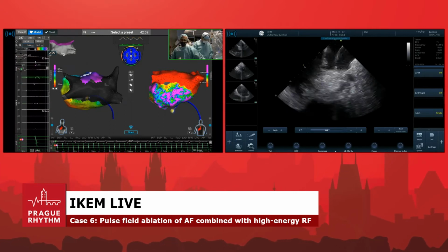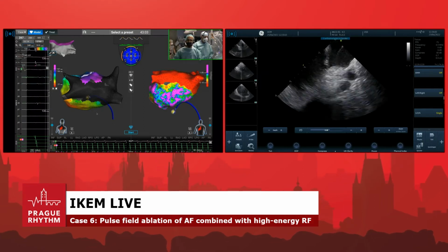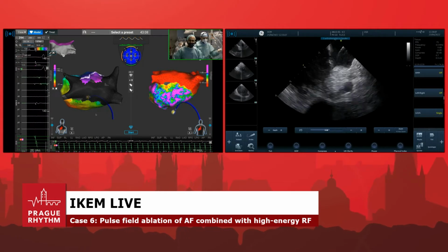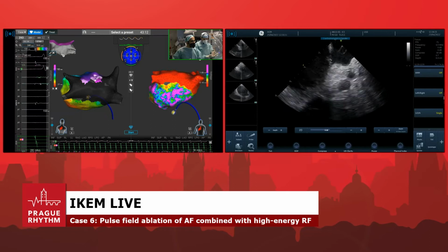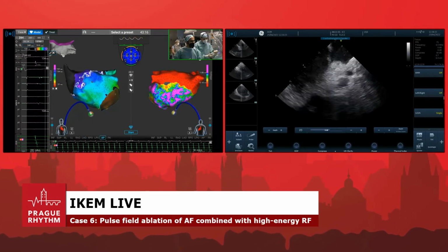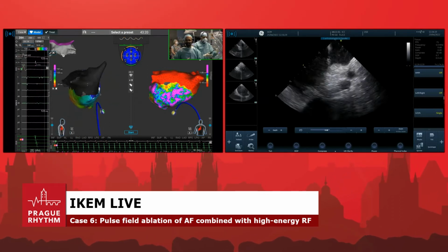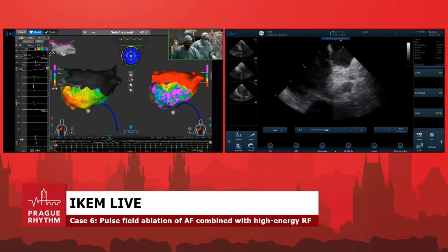When we looked on ICE at the left ventricle, we did not see any stunning that you often see with an air embolus. There is usually also staining of the myocardial wall with a kind of microbubble, so it's really white because the air is echogenic. We also saw small bubbles in the aortic arch, which is always the case when you have some small bubbles. So it could be bubbles.